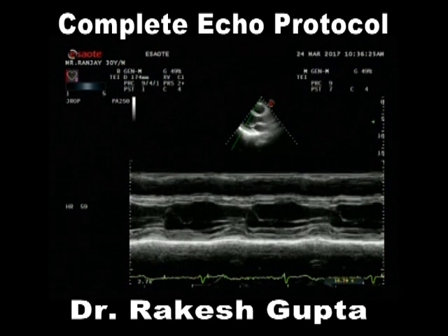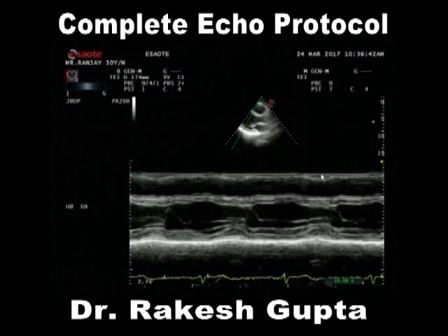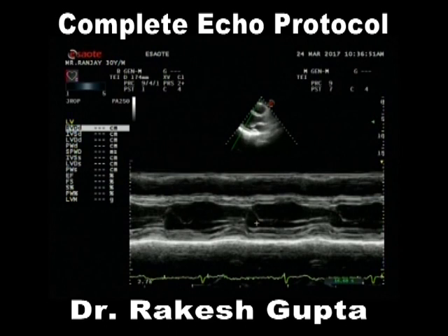Many of these things have been recently modified and adopted by the American Society of Echo for calculation of various chamber dimensions. And once we have seen this, let us see how we calculate LV dimensions. At this point, look at what exactly these dimensions ask for. If you look at the first top dimension on the left hand side, I saw many people measuring the interventricular septum directly.